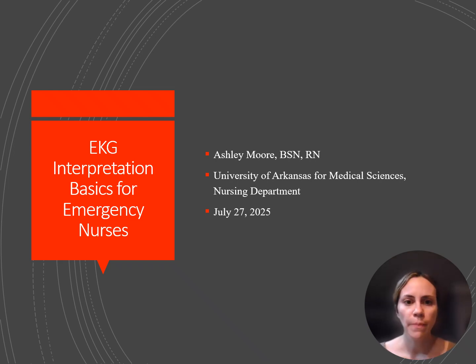So let's get started. This presentation, as I said, is for emergency room nurses. And why is this so important? EKG, or electrocardiogram, interpretation is a critical skill for nurses, enabling early recognition of life-threatening cardiac events such as STEMIs, ventricular arrhythmias, and asystole. In high-stakes environments where every second counts, the ability to rapidly interpret EKGs can mean the difference between timely intervention and avoidable deterioration. This session is designed to build foundational and clinical competence in EKG interpretation for frontline nurses.